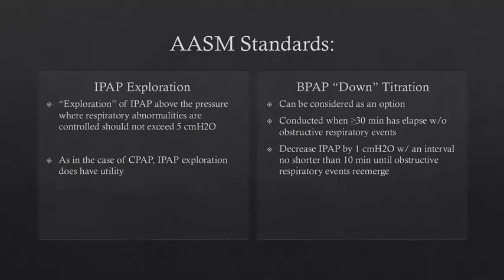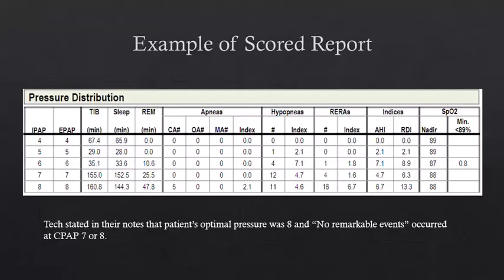So this is all well and good. We know how it goes by standards, what we're supposed to do. But here's how it looks in real life. And in real life, it's not always as simple. So I found going from night tech to score tech, it helped to see what the physicians are looking at in order to make that decision to find what the optimal pressure is for the patient.